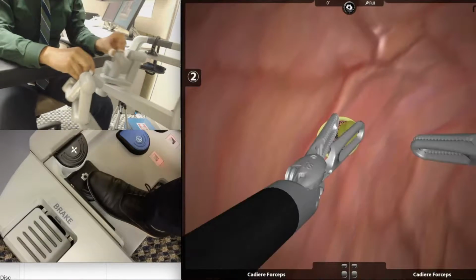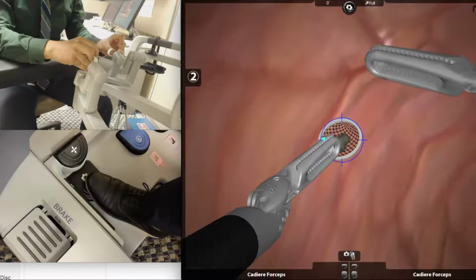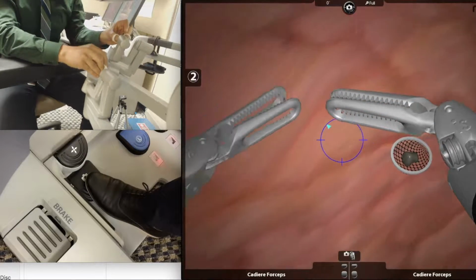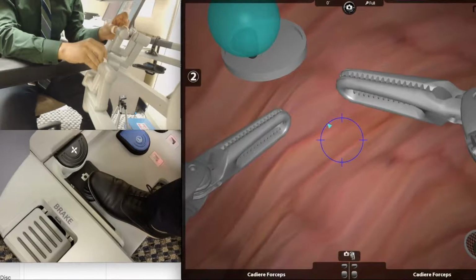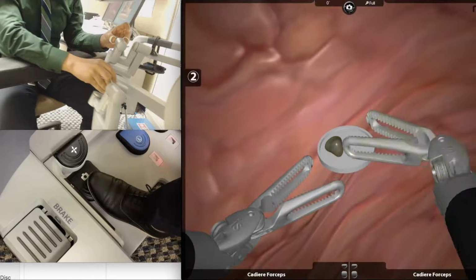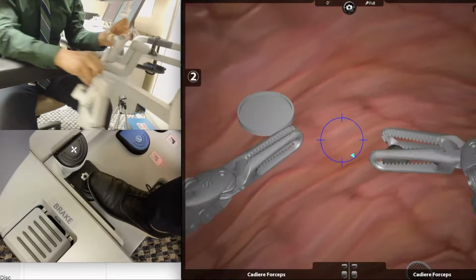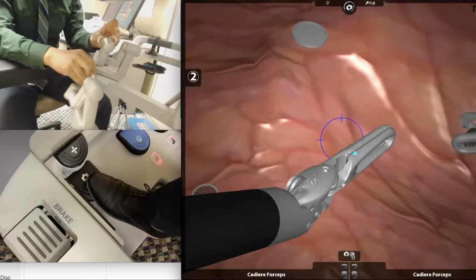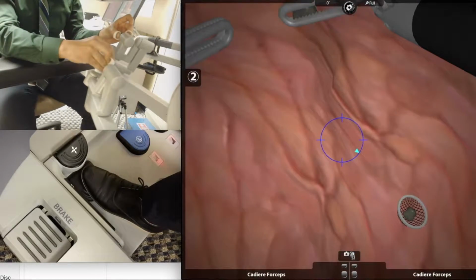It is normal for the camera to be off horizon by 45 degrees. Check your horizon at regular intervals and correct it prior to moving on to the next target. Try to always grasp the object with the tip of the grasper to avoid it slipping and also give you maximum control. For the last target, I will advise you to move slowly, as most of you tend to over-rotate and miss the target.